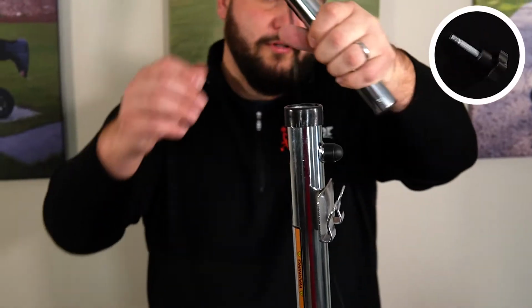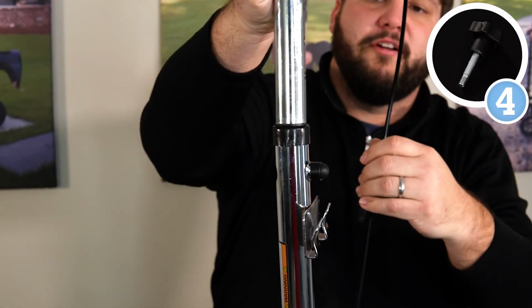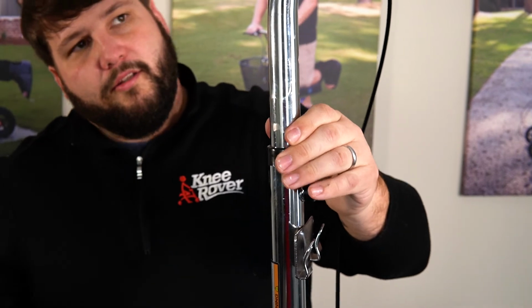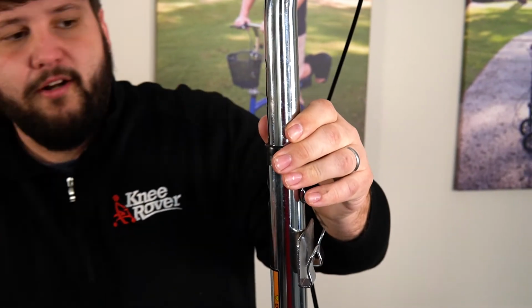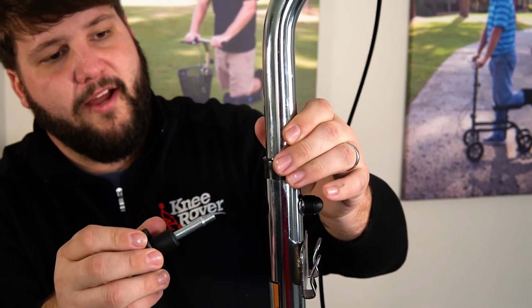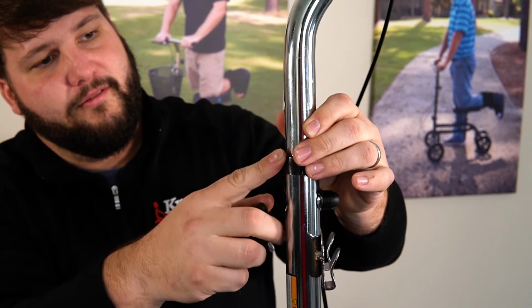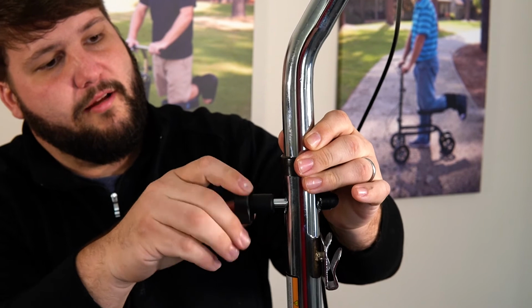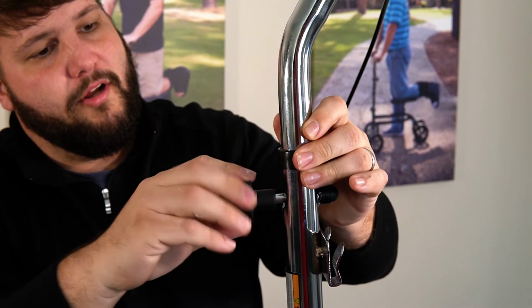Step number 4 is going to be installing your steering column and handlebars. So you'll just drop that in there. You'll take your height adjustment knob and find your desired height. There's holes here. And you're going to take this knob and just put it in and screw it all the way in.